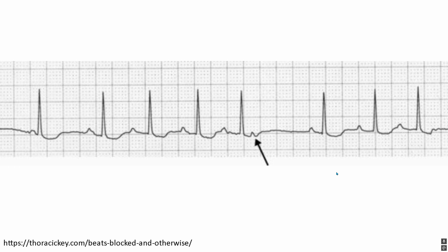Now, this is an example of a premature atrial contraction, okay? Like we did before, let's go through P, QRS, P, QRS, P, QRS, P, QRS, P, QRS, P, no QRS. However, when we look at the P to P interval, it's changing, okay? This P to this P distance is the same as this P to this P, but look at this difference, okay? This distance is much shorter.